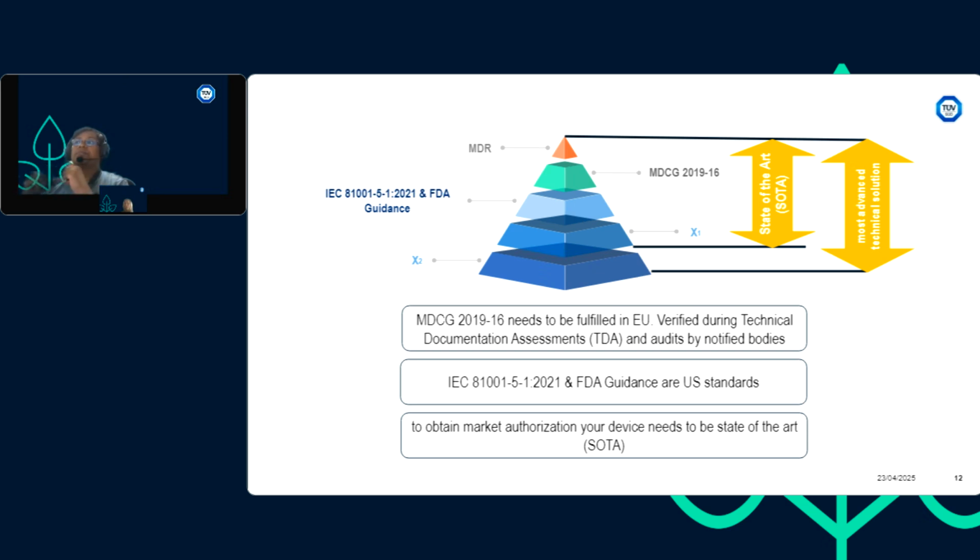And particularly we need to consider this in a very detailed way. We need to keep doing the things, and that's why we at TÜV SÜD say security is not a state that you will reach. It's the process by which we operate, and we do the retesting multiple times. We go through this process in an iterative fashion. Every small change we make, we again go and follow the process. Similarly, in case of security, we need to do the same.